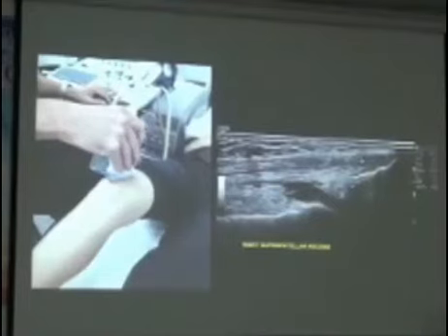And it's very common to get enthesophytes or tractional insertional enthesophytes on the patella at this location.